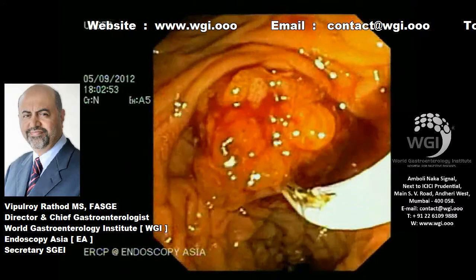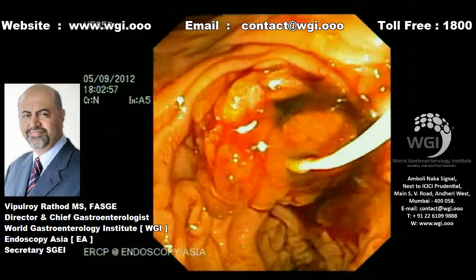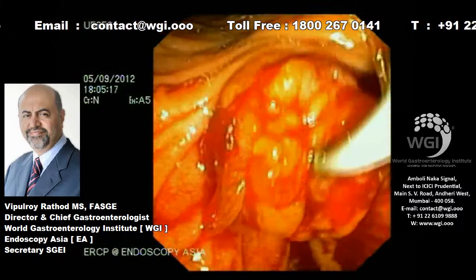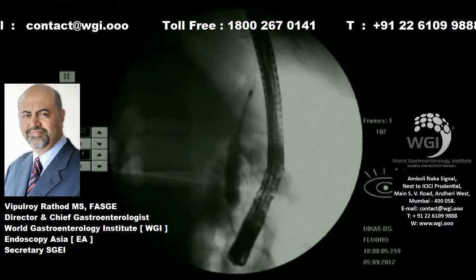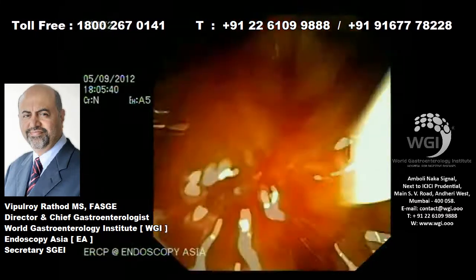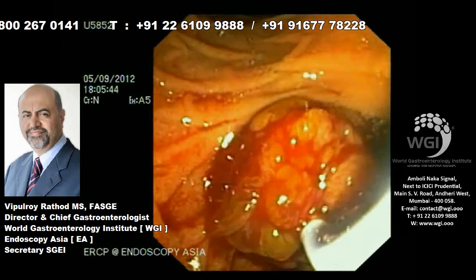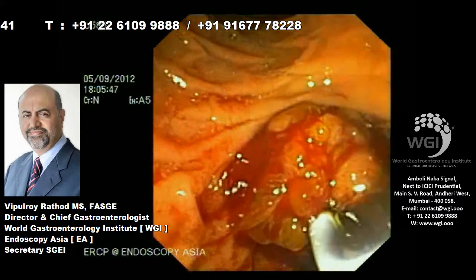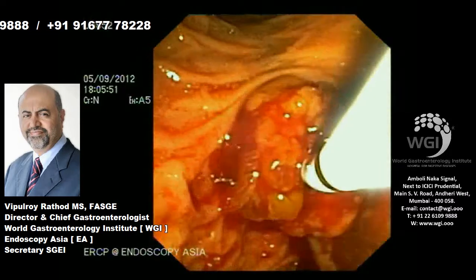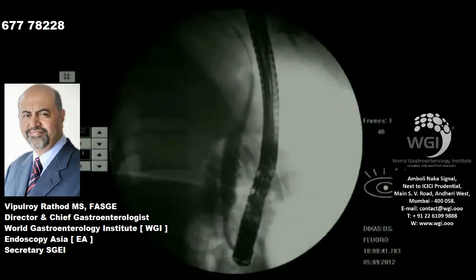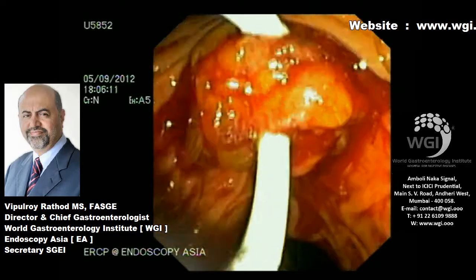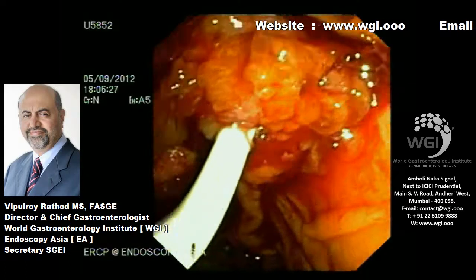Standard practice: whenever we have a proliferative lesion like this encountered in the ampulla or peri-ampullary region, I prefer to leave a double pigtail 10-French stent rather than a straight stent, because we do not know the final clinical follow-up of these patients. The double pigtail stent will continue to drain even if the tumor proliferates, if surgery is deferred for any reason. You can see the inner pigtail opening up and the outer pigtail completely in place with a marker.